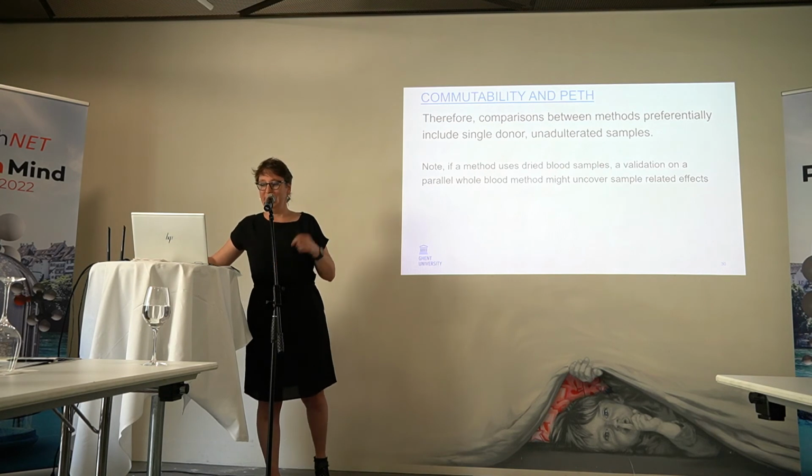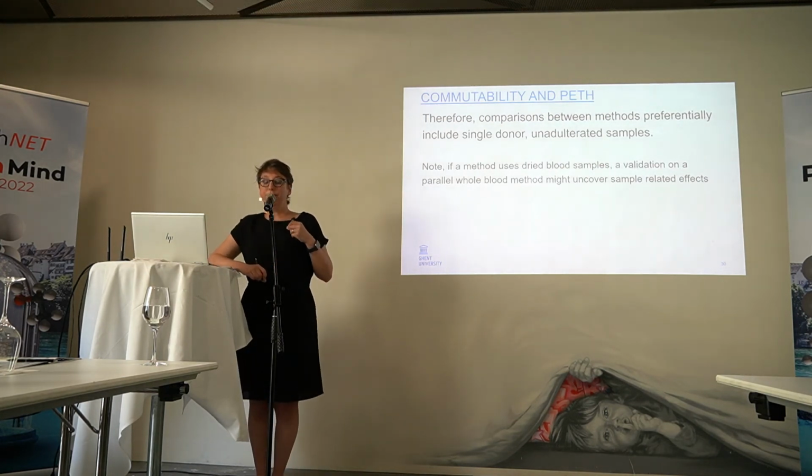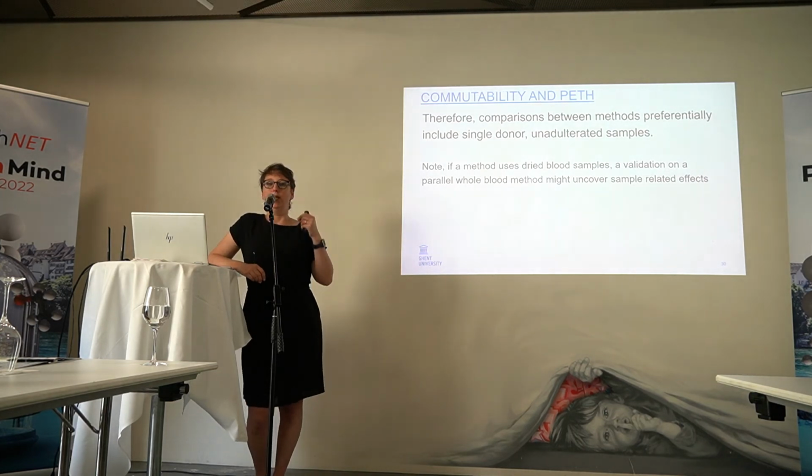So if we compare different methods, we should include single donor unadulterated samples. These are the samples that we will be using the method for, and the samples you need to use when you compare methods.